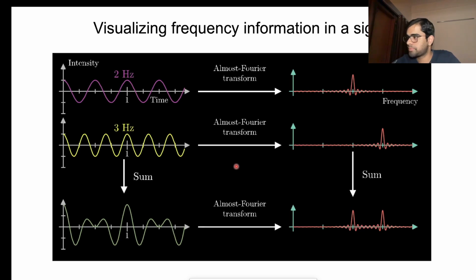To conclude with what Deepak has told, a signal is a combination of sine waves with different frequencies. When you are understanding the signal in the frequency domain, you can understand the frequency components present in the signal. With respect to EEG, we can confirm that the signal is in the range of 0.5 to 40 hertz or so, which is based on our study. And we can also understand whether any noise is present. If there is power line noise, we can find a peak at 50 hertz, so that we can use appropriate filters to remove that. Am I right? Right, right.